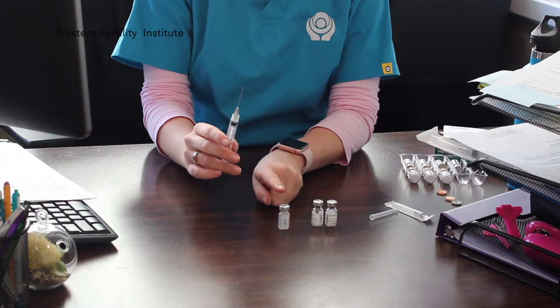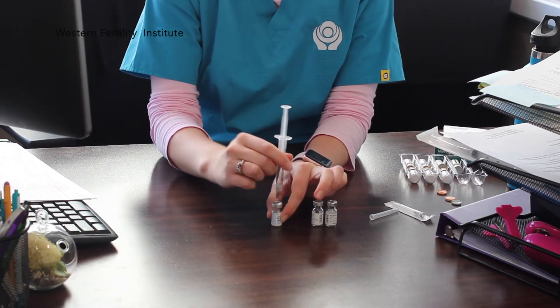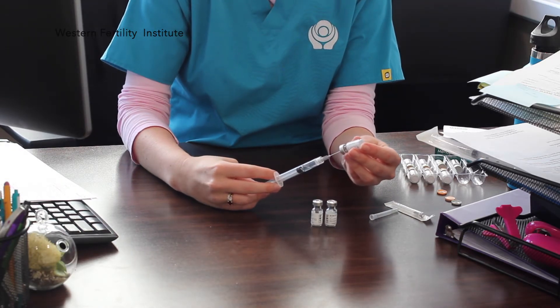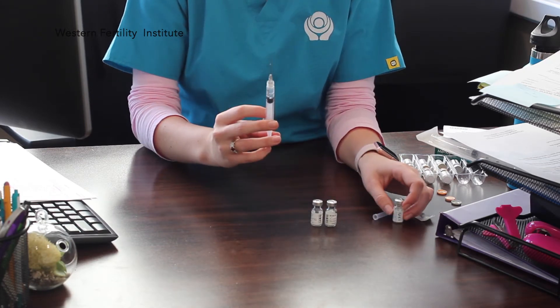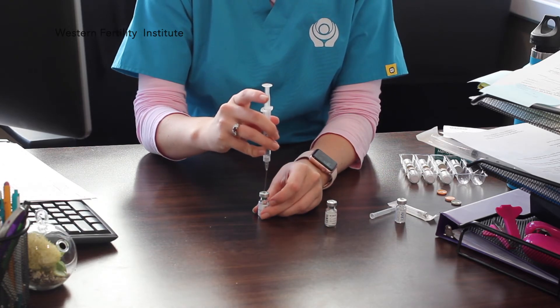I'm now going to draw 1cc of the sodium chloride. Now that I've drawn 1cc of the fluid, I can then inject it into the powder.